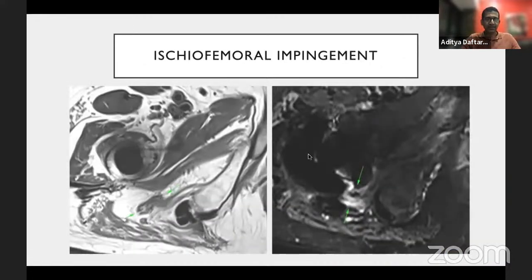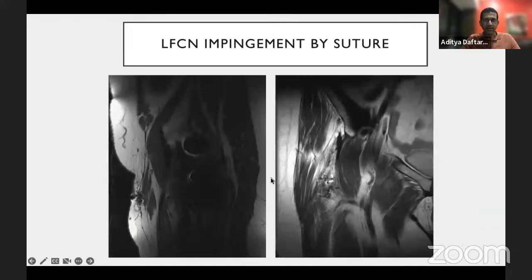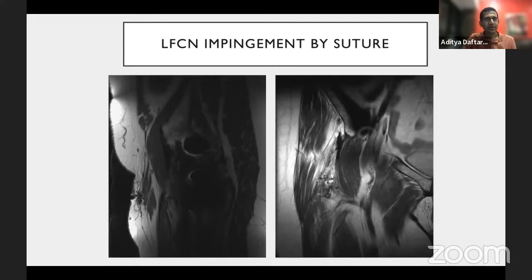For neurovascular structures, MR lets you see them very well; superficial ones can be seen on ultrasound. Here's a normal peroneal nerve and a thickened, edematous, partly injured peroneal nerve. We recently saw a patient where the sciatic nerve was thickened and edematous on MRI, and CT showed mature heterotopic ossification almost encasing that sciatic nerve — that's the cause. We can also identify ischiofemoral impingement: narrowing of the ischiofemoral space with thickening and edema along the sciatic nerve indicates symptomatic impingement. Scarring along the lateral femoral cutaneous nerve explains anterior symptoms after anterior approach surgery.